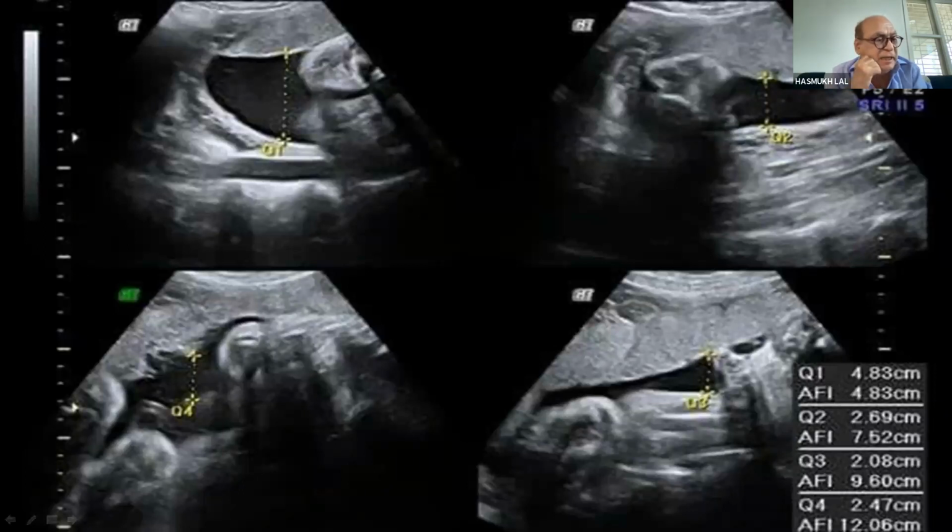The transducer is kept transversely in the lower abdomen, just above the symphysis pubis. It is transverse. Only when we measure the amniotic fluid does the transducer have to be in the sagittal direction. The direction is changed. And I would like to emphasize, this point was already told, we never rotate the transducer more than 90 degrees. There is a notch, and the notch is towards the patient's right.